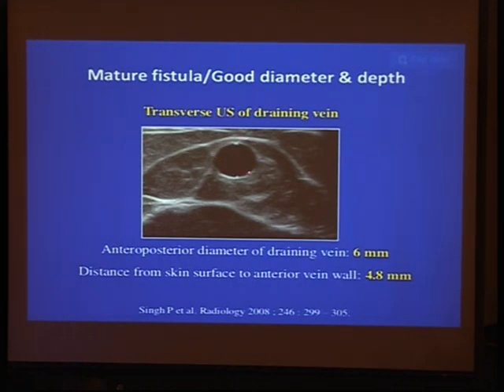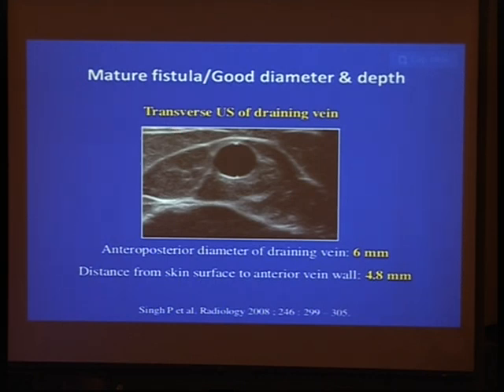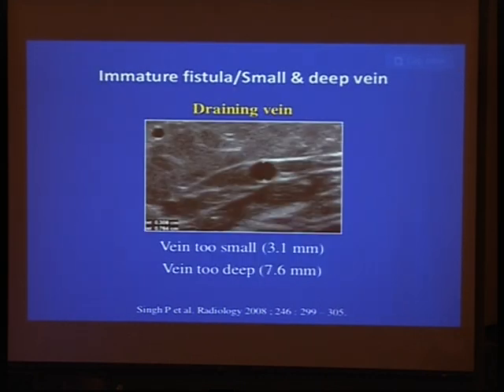This is the draining vein at 6 mm — more than 4 mm — and the distance from the skin is less than 5 mm. So it is a mature fistula. The fistula evaluation done two months after creation shows a diameter of more than 5 mm and distance from the skin of less than 5 mm, confirming a mature fistula.